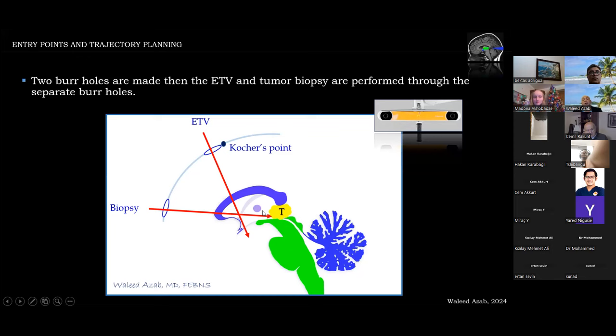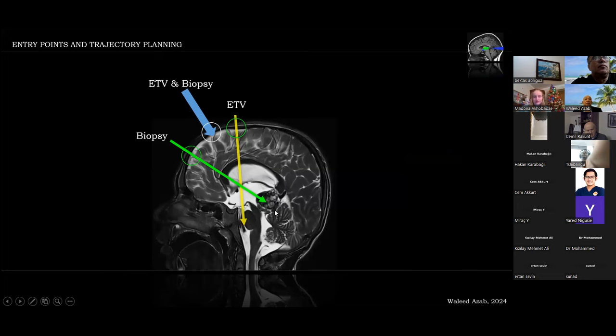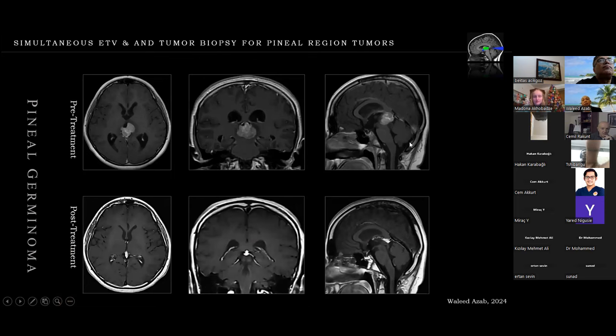Here is a representation of the two strategies on a sagittal T2 MRI. The biopsy technique is demonstrated in this case of a pilocytic astrocytoma of the pineal region. This is an initial view of the tumor; three to five maximum bites with the biopsy forceps are taken. Here is one example case of a pineal germinoma — pre-operative MRI is shown, and ETV with biopsy was performed.